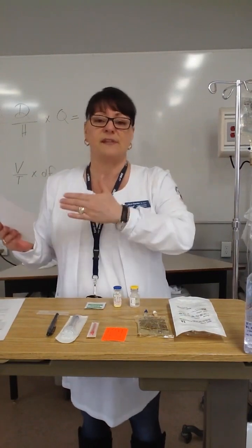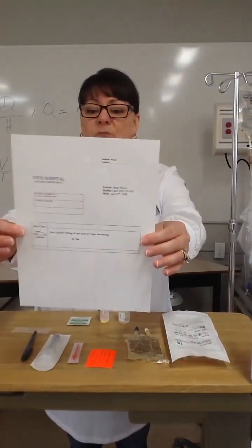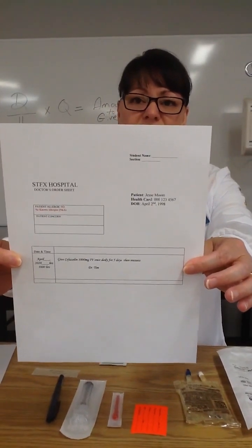So for starters, I'm going to review my doctor's order. Anytime I receive an order for a medication, there's a set of steps that we follow. If you get into the habit of always following these steps, you'll always be really safe in your preparation of medications. So when I receive the doctor's order, and we have an order here for cefazolin 1,000 milligrams IV, you can see that.